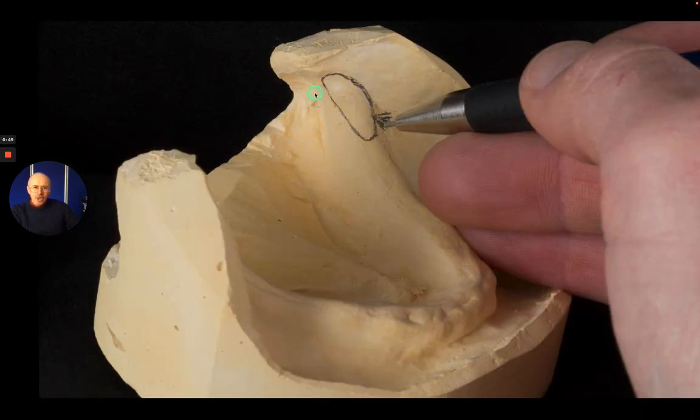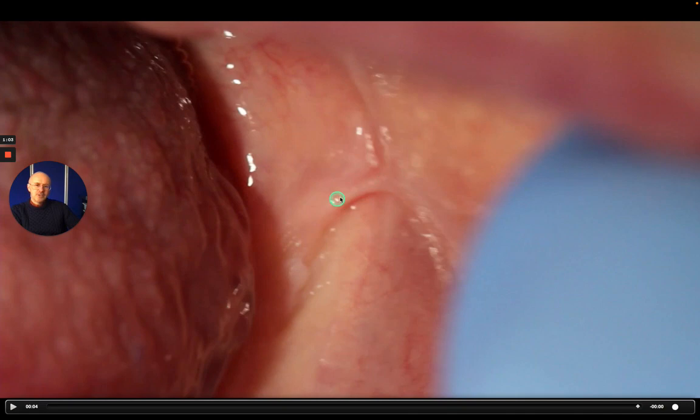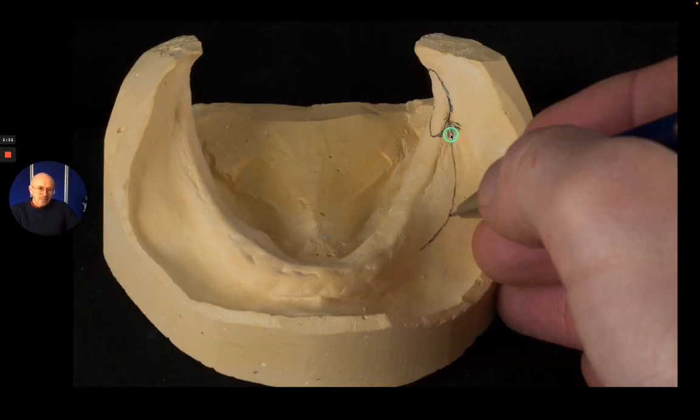So first of all, on the primary cast the retromolar pad is just drawn around, and there's also a little sinew that joins the base of the retromolar pad just like this. If you look in patients' mouths you'll often see this sinew, which is a connection of the buccinator. We've got to avoid that and then sweep around there. The second part is to draw this two millimeters before the depth of the reflection of the sulcus, so the special tray is slightly short of the full functional width and depth of the sulcus — two millimeters short. Sweep that forward and keep it out of the way of any frenum, which is usually in about the canine region.